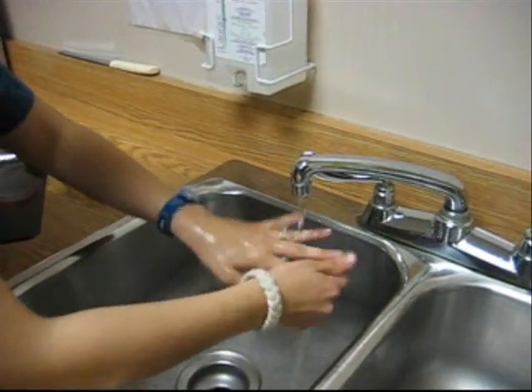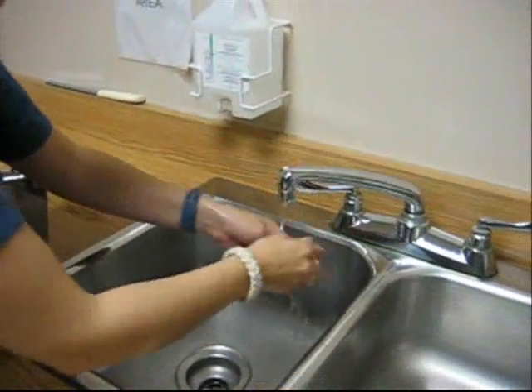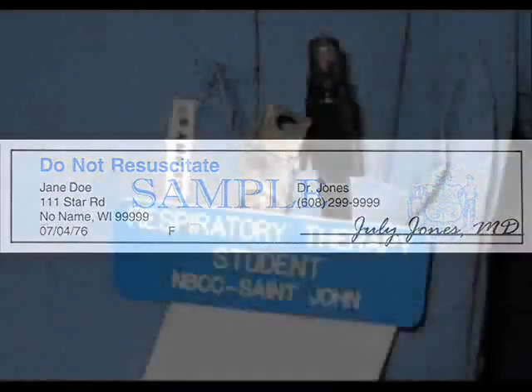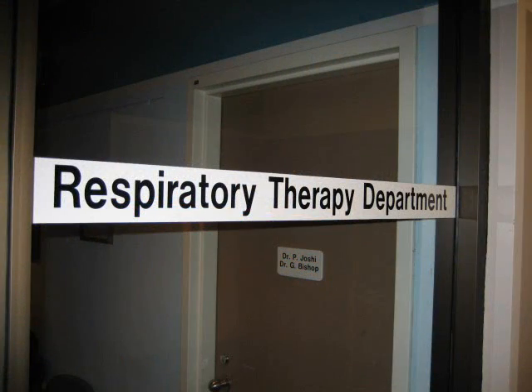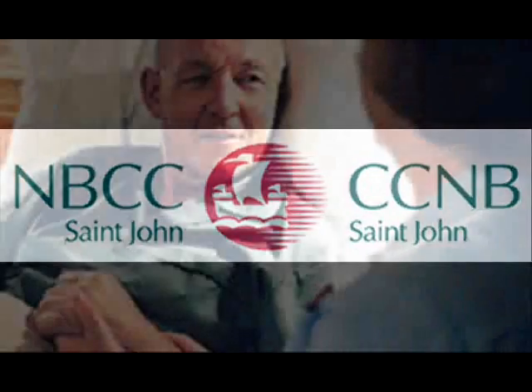Ensure that hands are thoroughly washed at a sink or with an approved alcohol-based hand product prior to the commencement of the procedure and the donning of gloves. Identify the patient, yourself, the department that you represent, and your role as a respiratory therapy student at NBCC SJ.